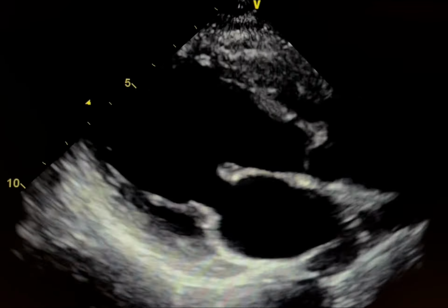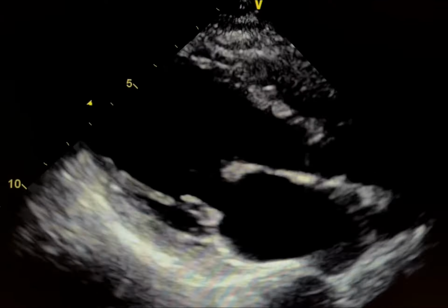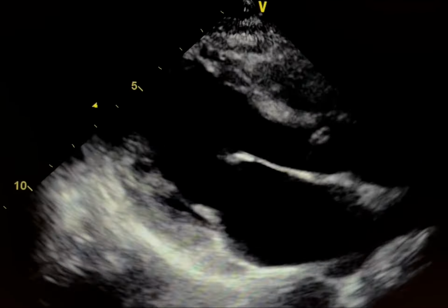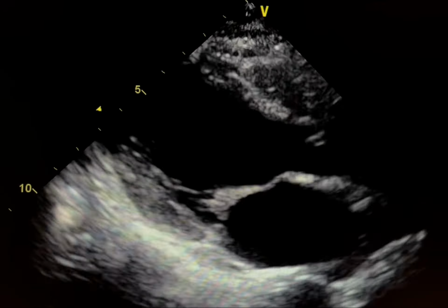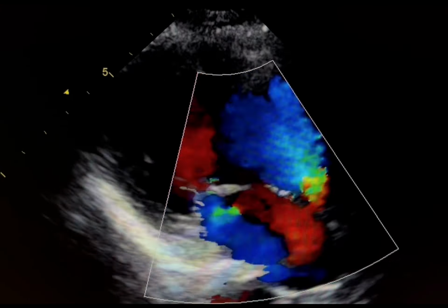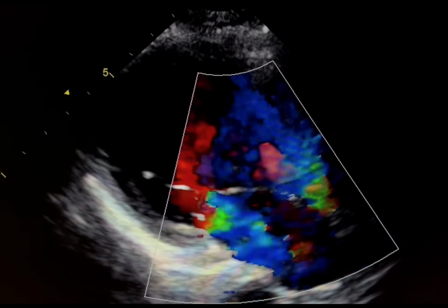Let's take a look at this echocardiographic study of a young woman with valvular heart disease. At first glance, rheumatic heart disease comes to mind due to thickening and doming of mitral valve leaflets. Significant mitral and aortic regurgitation are seen here.